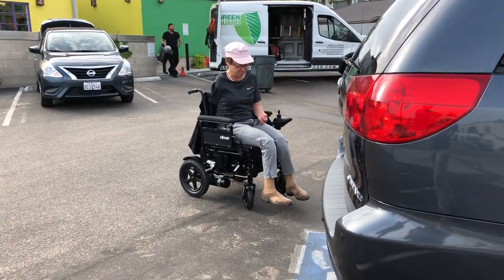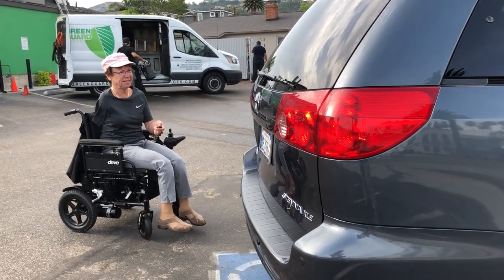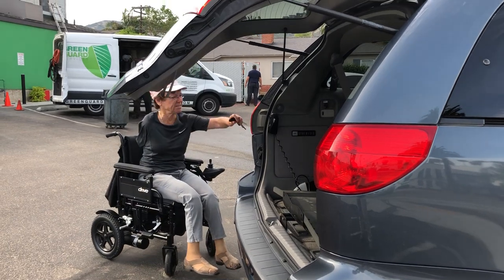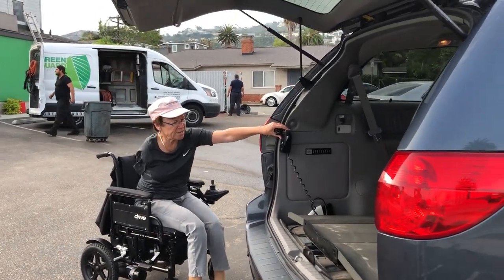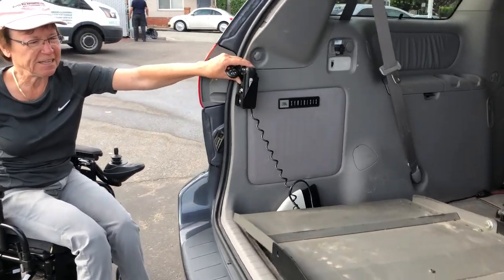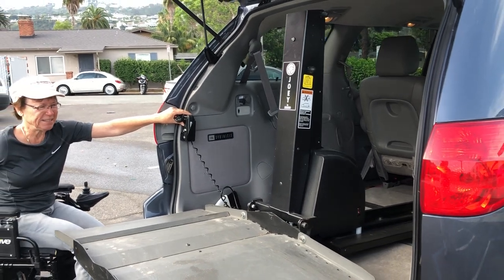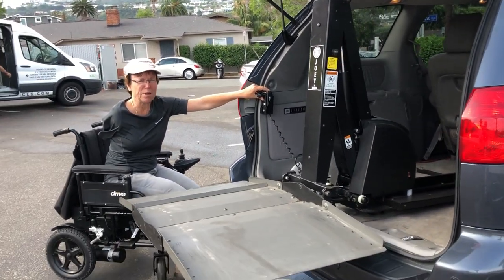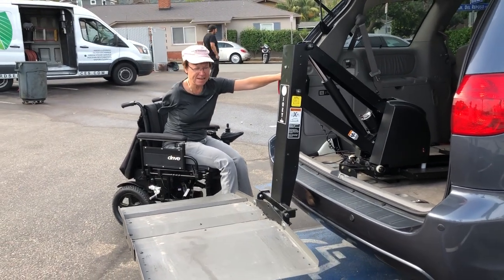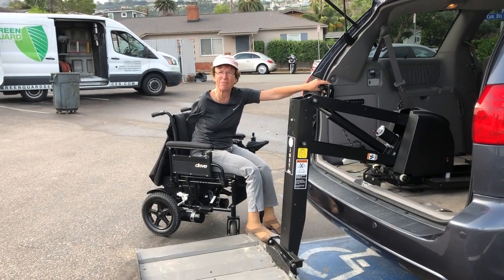Right now what I'll do is open my car. It helps to have electronic things. So this is a Joey device by Bruno, which comes out. It's kind of slow, but it works. And it allows me to put my wheelchair on here and not have to fold it up.